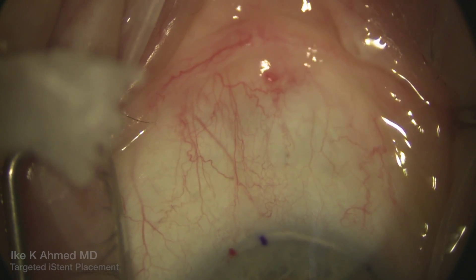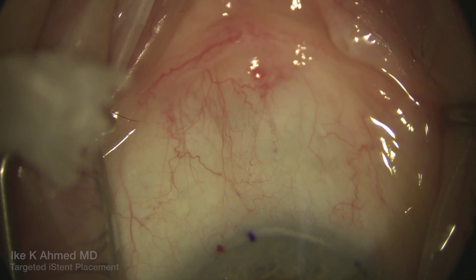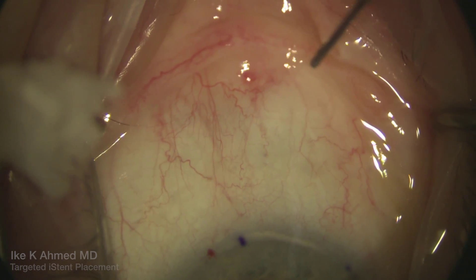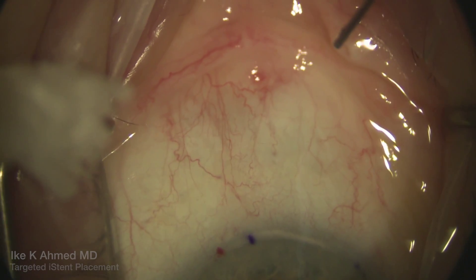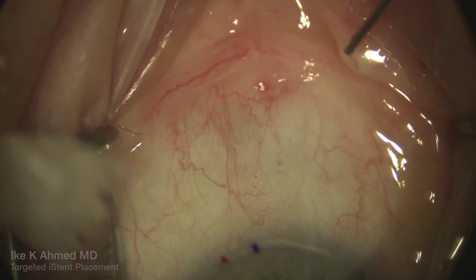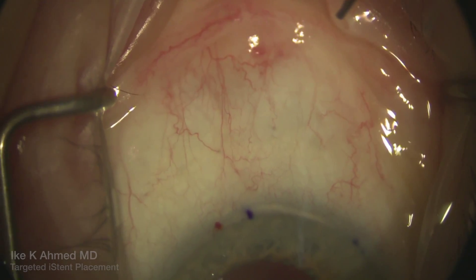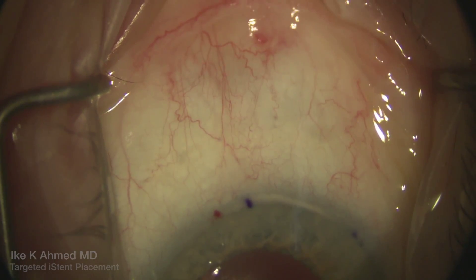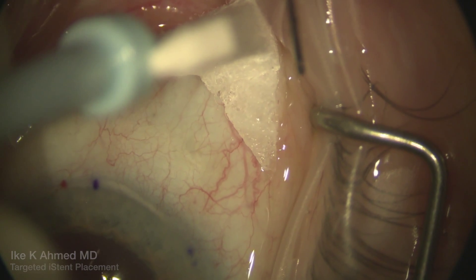This device looks to be placed quite well in terms of position, right by where that mark was placed at the limbus where the aqueous vein is. You will also note that some of the smaller vessels also blanch around the area infranasally as well.